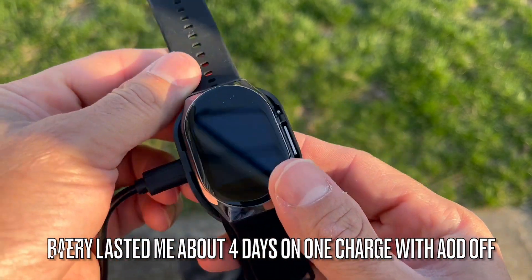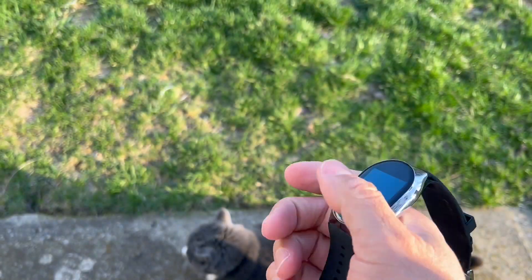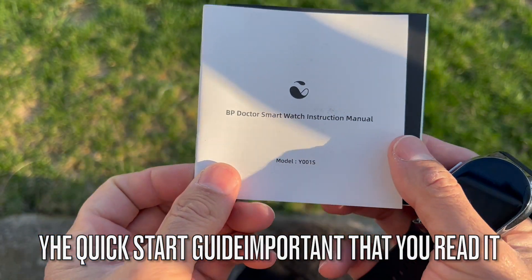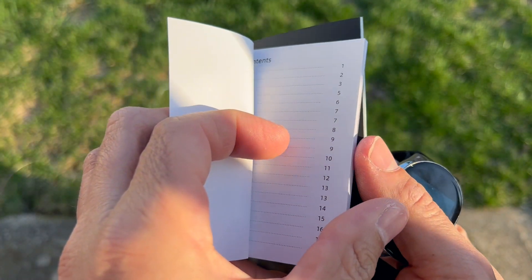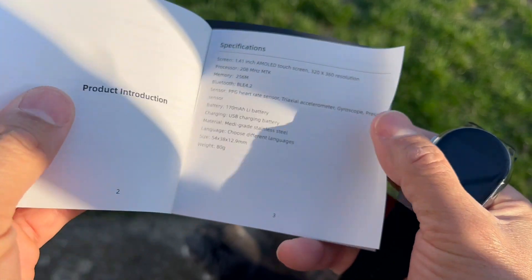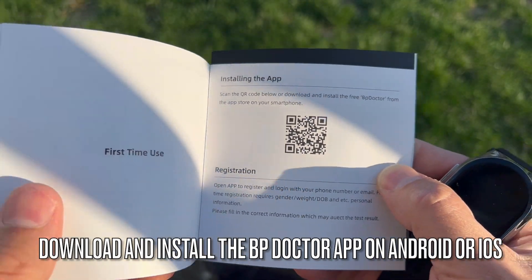The watch charges really fast and the battery lasts really long. You also get instruction manuals in the package — it's called the BP Doctor Smartwatch instruction manual. Inside, there's a QR code so you can download the BP app, available on both iOS and Android.